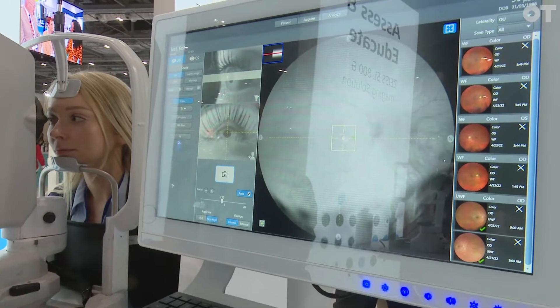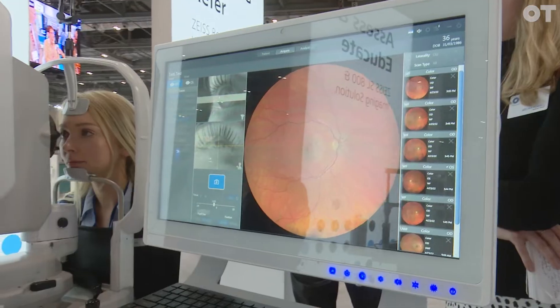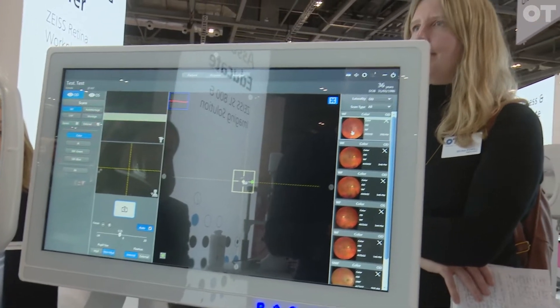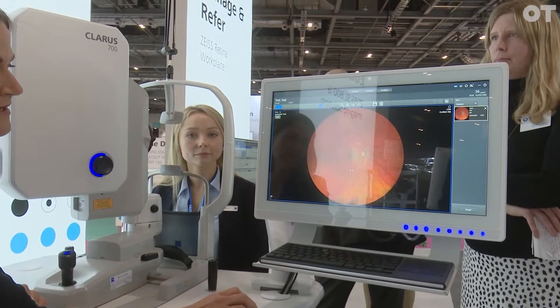It uses broad spectrum imaging with sequential illumination, using red, green, and blue LEDs — nice, easy, safe and comfortable for the patient. And you get this lovely true color image here, covering 133 degrees across.